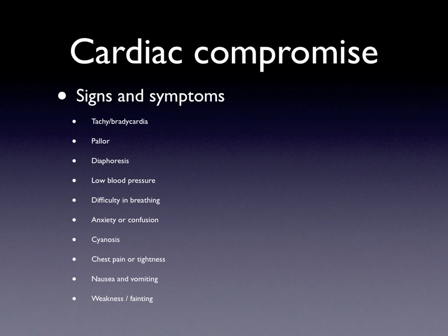Now, some patients may feel a little weak during the stress test, but what we're talking about here is someone who suddenly has to hold onto those handrails just to stand up, or who can no longer hold their own head up. Those would be signs to me that I want to stop that test.